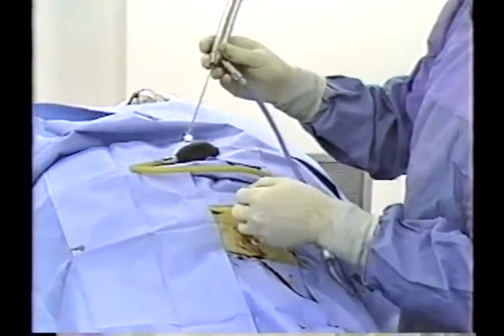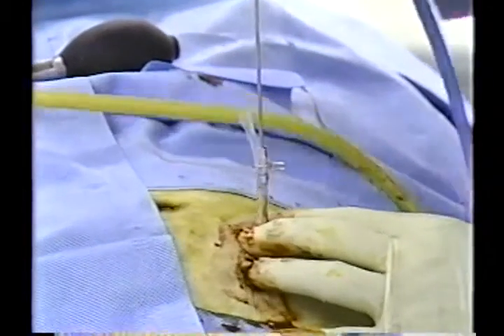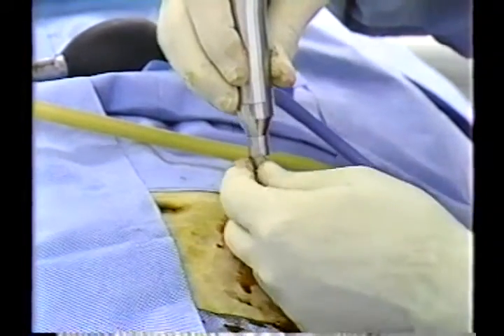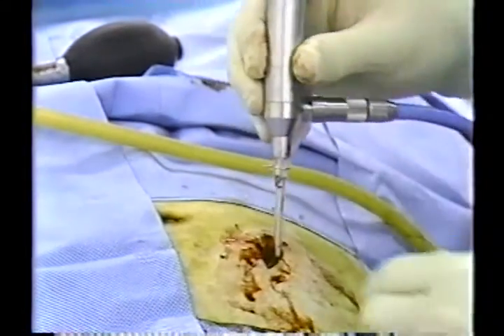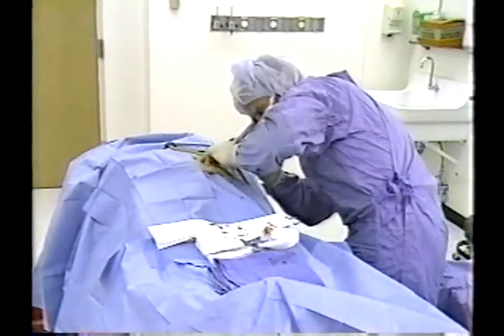After about 400 to 600 cc of air is in the abdomen, the needle scope is reinserted into the cannula and the tip of the scope directed into the intraperitoneal air bubble. Once the intraperitoneal air bubble is identified, distal vision is obtained. The patient is then lowered into the Trendelenburg position to increase the visualization of the lower peritoneal space and to obtain clear visualization of both the right and left inguinal area.